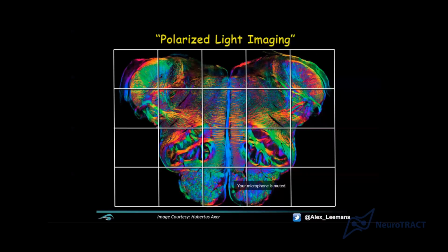These sections, these slabs, they don't have an isotropic resolution. They have an anisotropic resolution, which is not beneficial with respect to biases and crossing fibers. It actually cannot disentangle crossing fibers within a voxel. So it has the same issues as DTI, but it has a very high resolution. So that's cool.